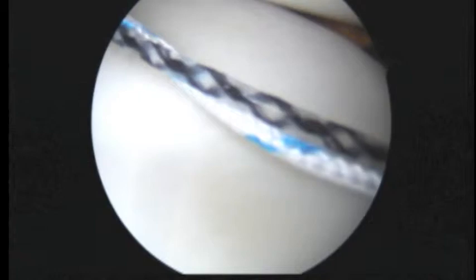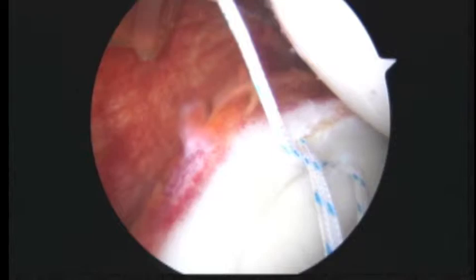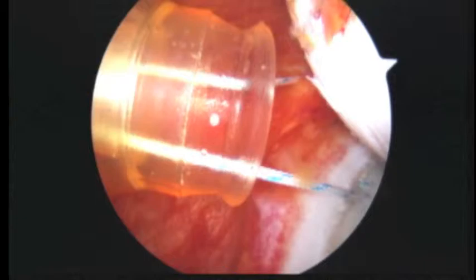As we slowly pull back, you can watch and see what happens — see how it brings that suture underneath and out the back. Now we have it passed around. The next step is to go ahead and tie that.